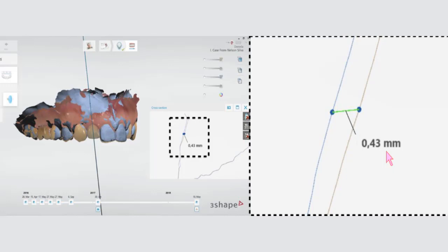Assuming that this data is correct, we have, ladies and gentlemen, in our hands a very powerful method to identify the difficulties in implant therapy, especially when you graft immediately after the implant is placed. We needed to understand that much better. So that's the digital integration that I have in my practice.